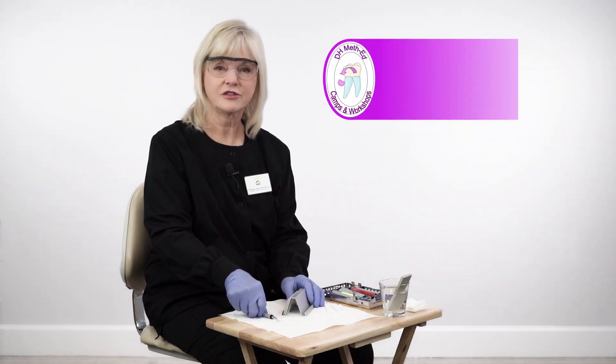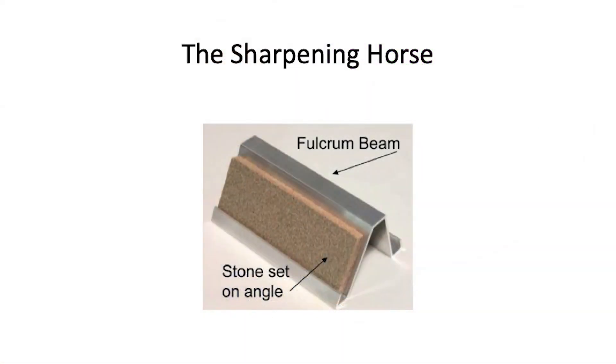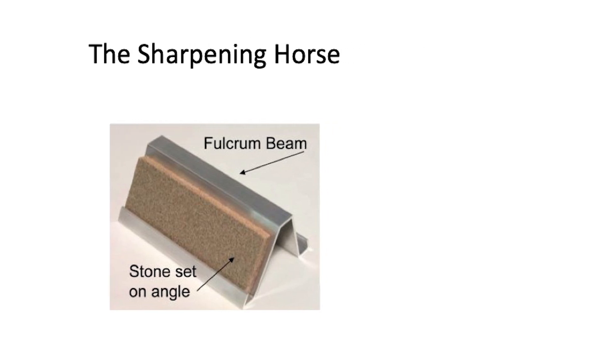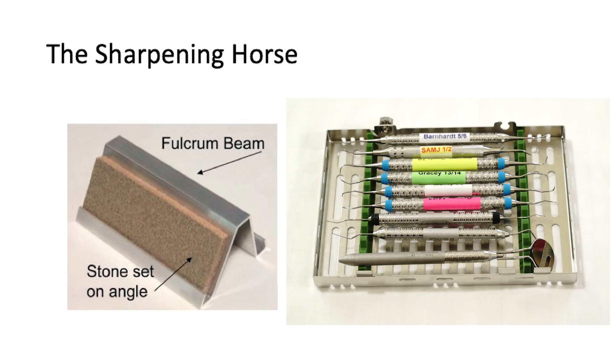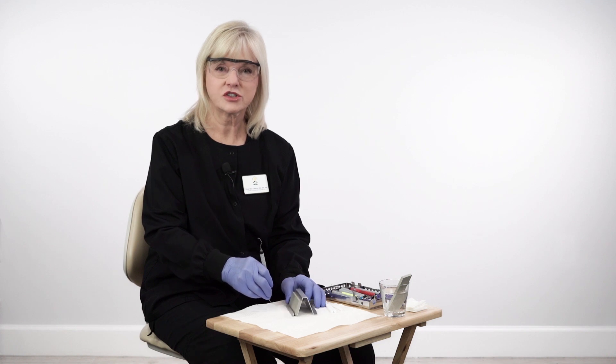I'm Cindy Byron, and I am the inventor of the sharpening horse, which is the latest technique for sharpening instruments to provide a nice crisp cutting edge on all of your periodontal instruments. We're going to have a demonstration now on how to use the sharpening horse with all the various basic instruments for dental hygiene instrumentation. I'm going to show you the basic technique for sharpening each instrument and the method in which the sharpening horse holds the stone at the proper angle for the bevel of the blade.